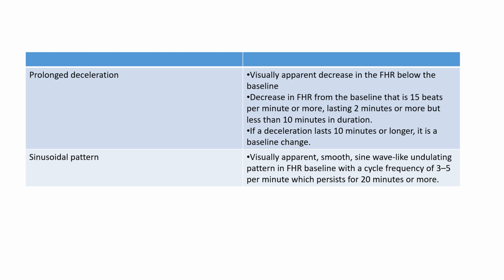Sinusoidal pattern, this is seen in hypoxic fetus. It is a visually apparent, smooth sine wave-like undulating pattern in the fetal heart rate baseline with a cycle frequency of 3 to 5 per minute, which can persist for 20 minutes or more.